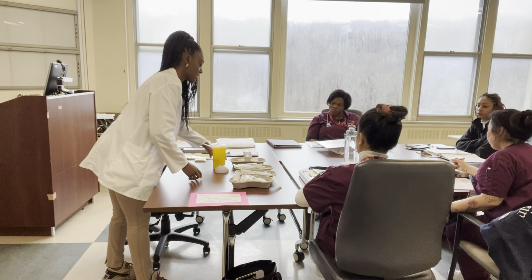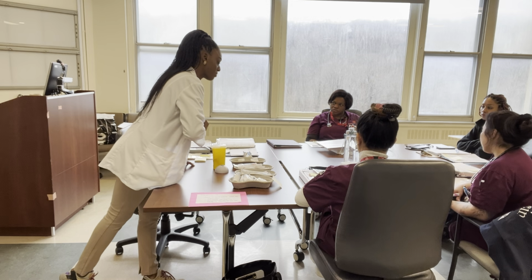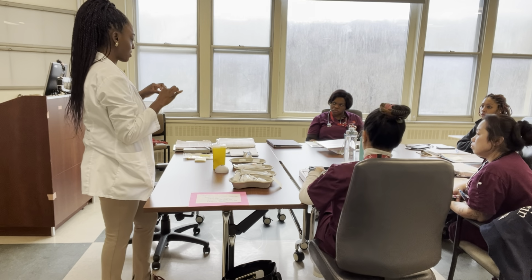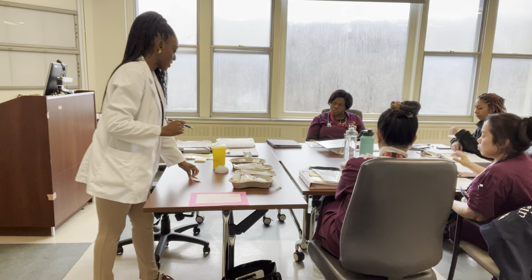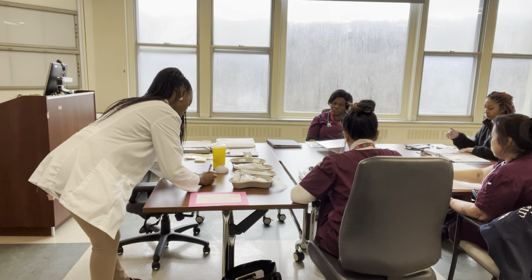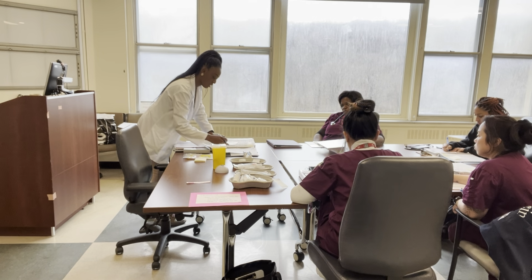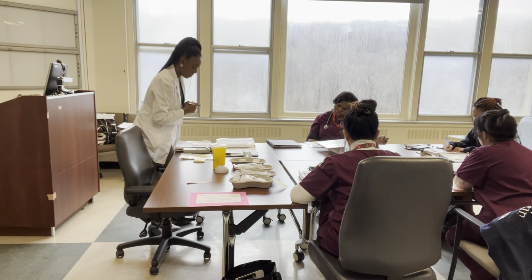So the first process is, when you are preparing insulin for your client and you decide on how much to administer, you need to write down all the information on the label that you're going to put on your patient's syringe. So don't forget to take notes, because you will all be doing this afterwards, okay? So for example, this is for Miss M. I'm going to write Miss M, and then whatever room number she's in. And once we finish looking at the protocol, we're going to determine the amount of insulin to administer for her. So I'm going to say it's supper time, and today we'll pretend it's October the 6th.